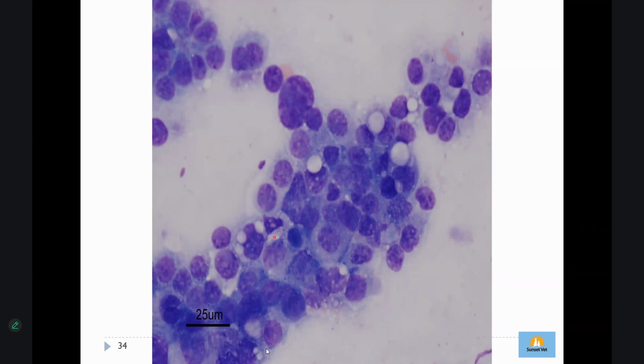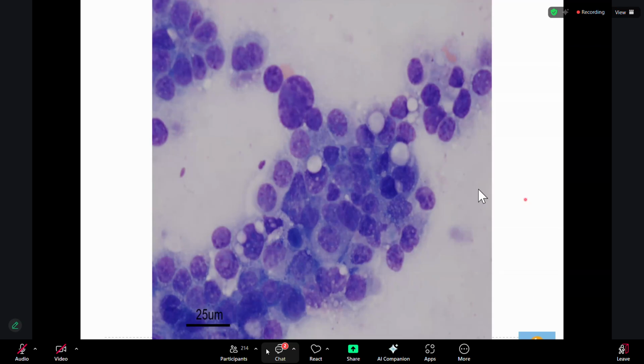Okay, from all of these, which one do you think? Let's think about the easy things. If it's cancer, you need to think about epithelial, mesenchymal, or round cell. Which one do you think? You can see them, and you need to think, is this round or is this wispy? Please help me to answer that. Okay, round, round, round. Okay, good.